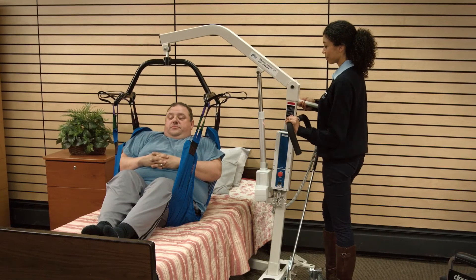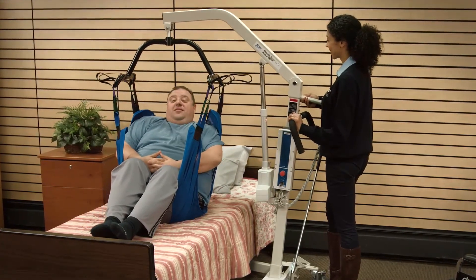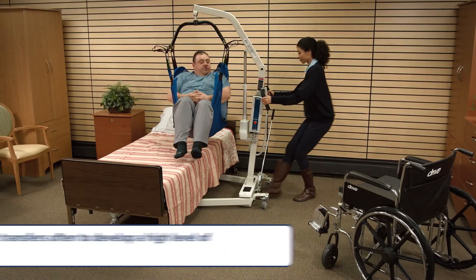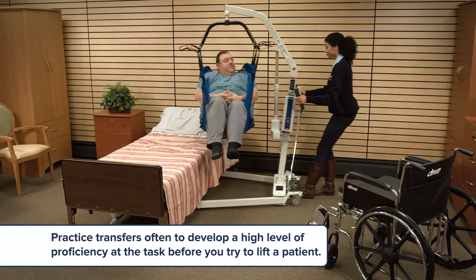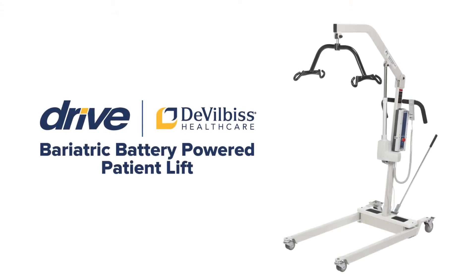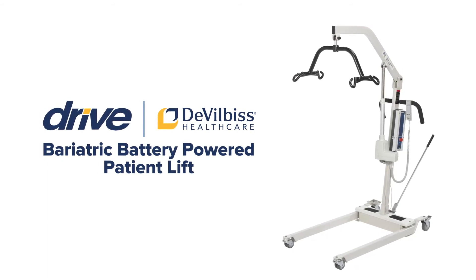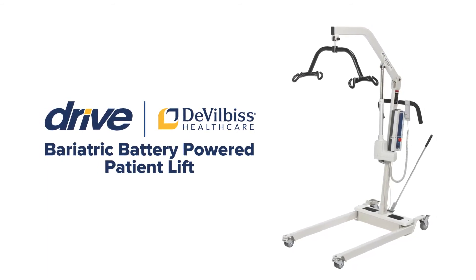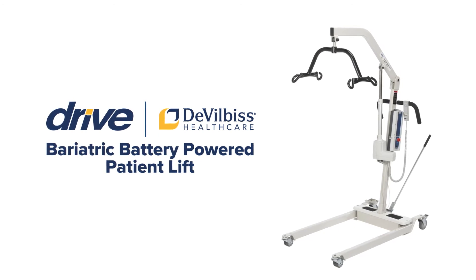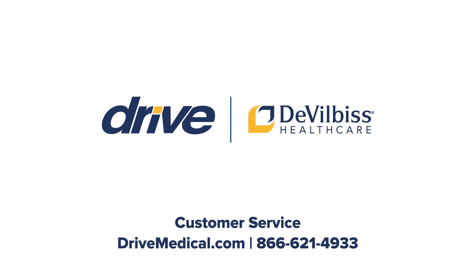The bariatric patient lift will provide you with a safe and comfortable way to transfer a patient from one resting position to another. Practice transfers often to develop a high level of proficiency before you try to lift a patient. Thank you for taking the time to learn more about your Drive DeVilbis Healthcare bariatric patient lift. Should you need any assistance in operating the patient lift, please contact Drive DeVilbis Healthcare or your registered medical provider.